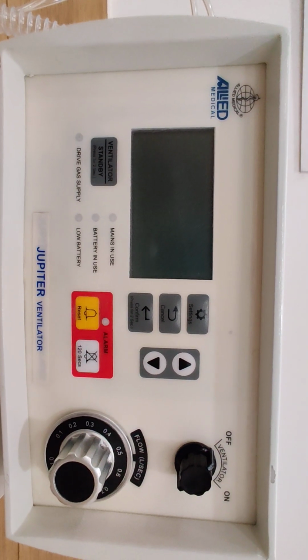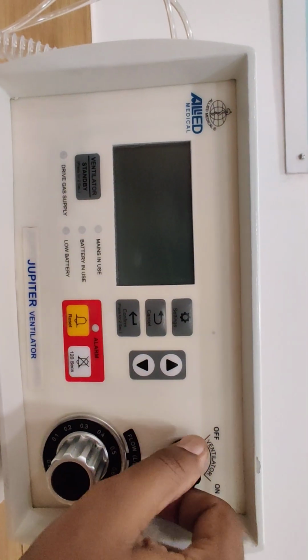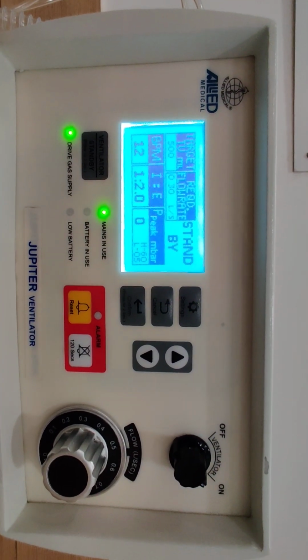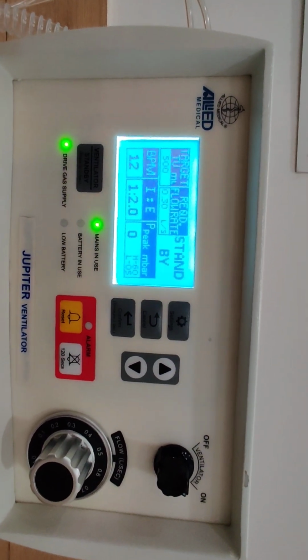Now coming on to the controls of this ventilator, it has this on-off knob over here. For turning on the ventilator, you have to move the knob up to the on position like this, and then you get a standby display on the screen over here.